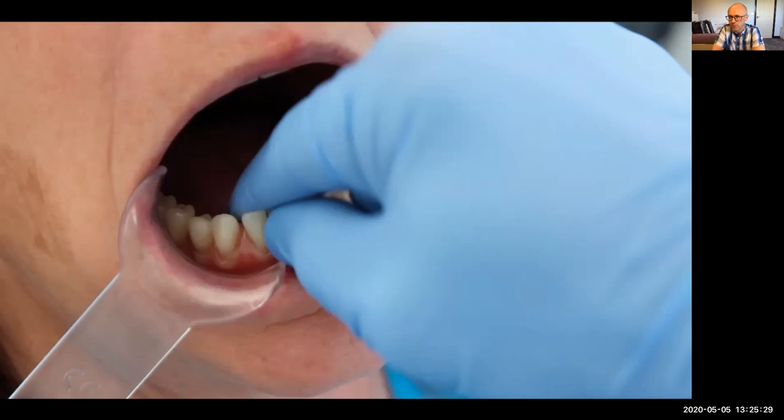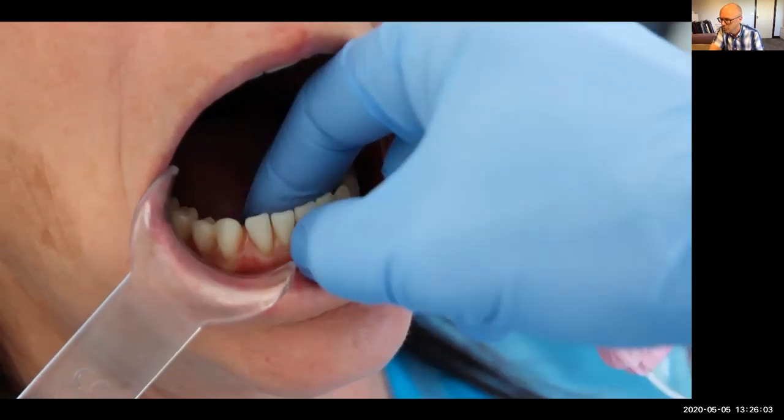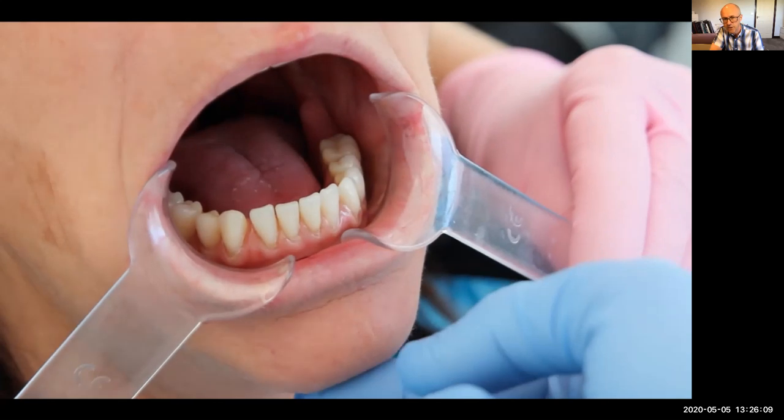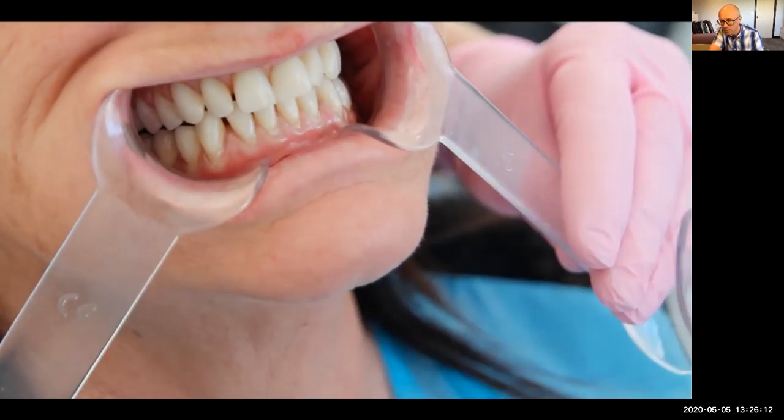And then the other thing I want to mention is this is Lynn's lower, and this is a video that I show patients before we proceed with implant retained lowers for 2 lowers, the McGill type approach. So 2 lower implants, I always show them this. We get good retention with these locators, but there's always a bit of rock. Watch this video now. This is very, very important. Look at how it can pivot. It's still really beautifully retentive, but the whole denture can pivot on those front implants.